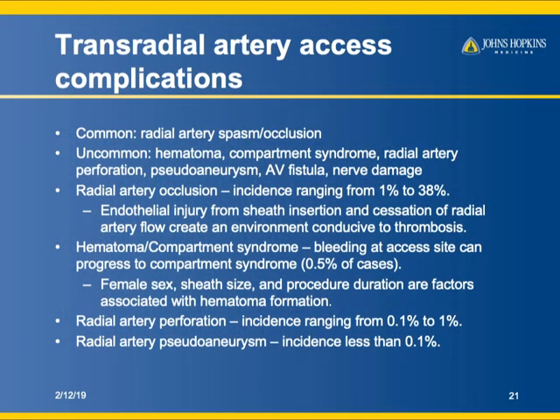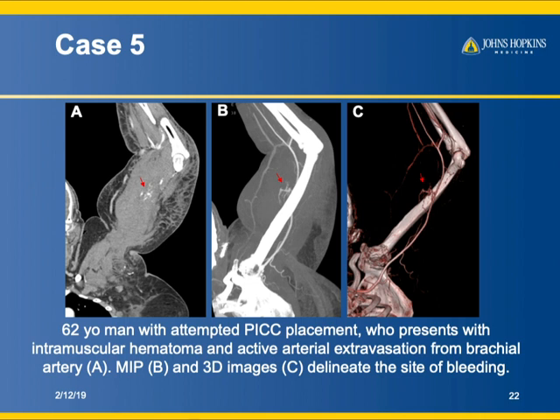Transradial arterial access complications include arterial spasm and occlusion. Less common are hematomas, radial artery perforations, AV fistula and nerve damage. Radial artery occlusion occurs in up to 38% of cases. Compartment syndrome from bleeding occurs in less than 1% of cases. Female sex, sheath size, and procedure duration are key risk factors. Radial artery perforation and pseudoaneurysms are fortunately very rare. Here's a patient with a recent attempted PICC placement who now has an intramuscular hematoma with active extravasation from the brachial artery — removing the bone makes everything easy to see.